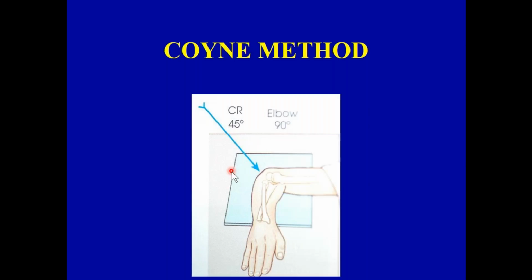What do we mean by larger? Well, the radial head becomes magnified, larger, so that if there is a subtle fracture in the elbow, we can pick it up. So it's an ancillary view if the doctor doesn't get enough information on the lateral. And the patient says 2 weeks later, I'm still having elbow pain. We could take the lateral view again, but we could also offer this method of doing the elbow examination. And if things are larger, a fracture should show up on a larger structure than a smaller one.